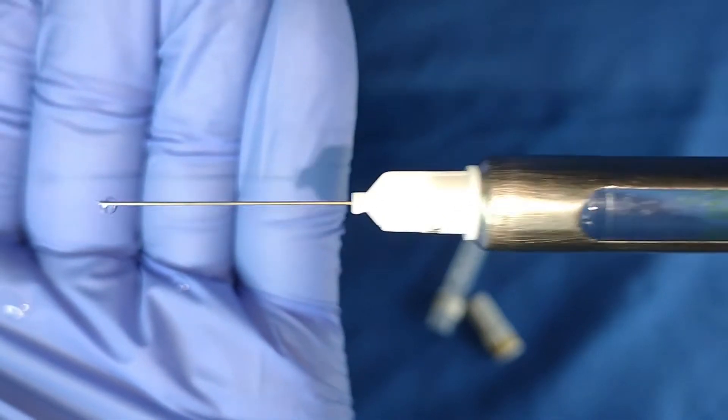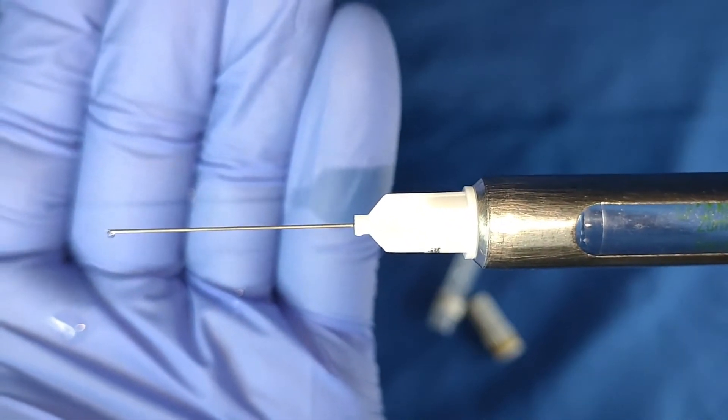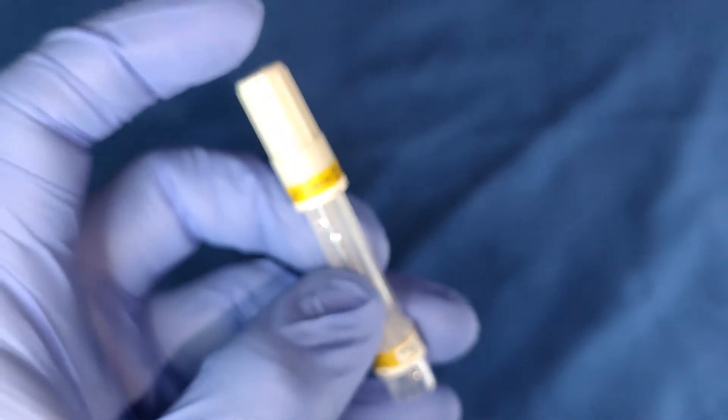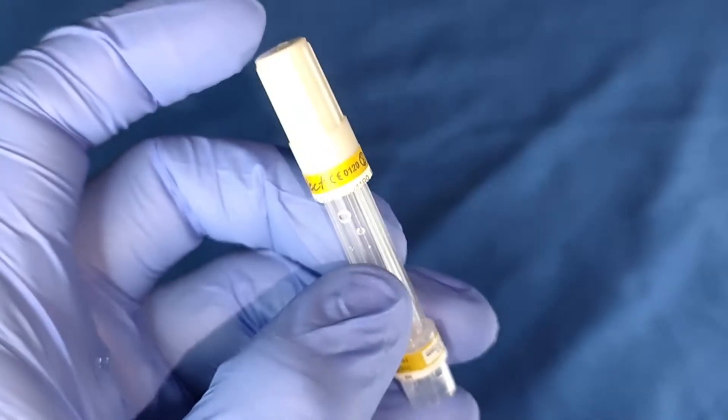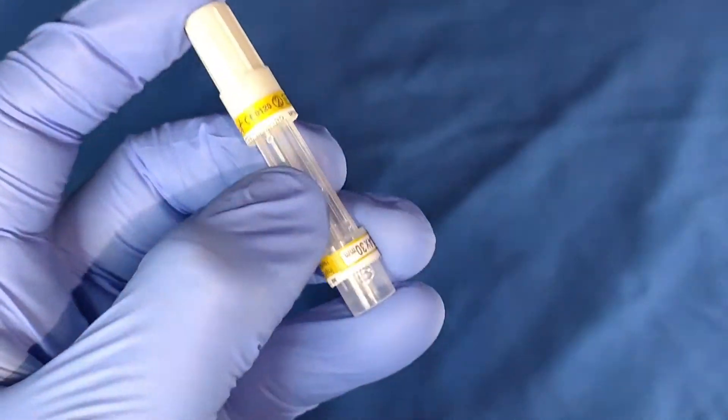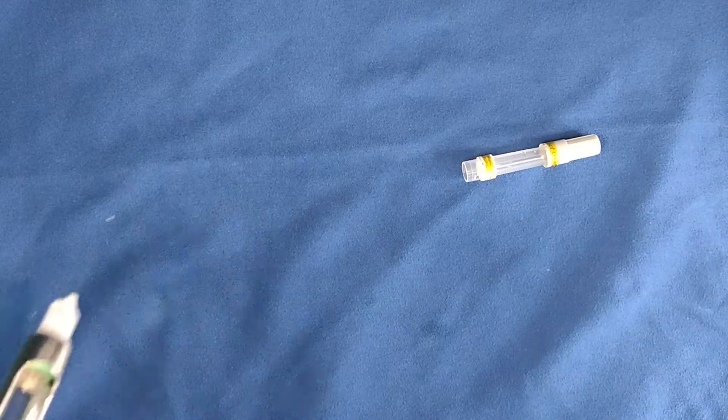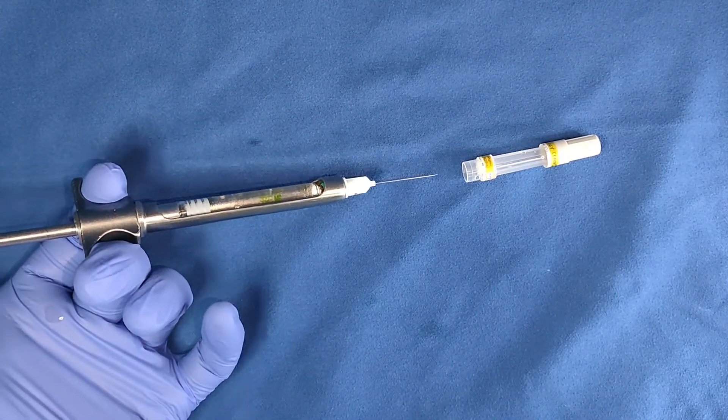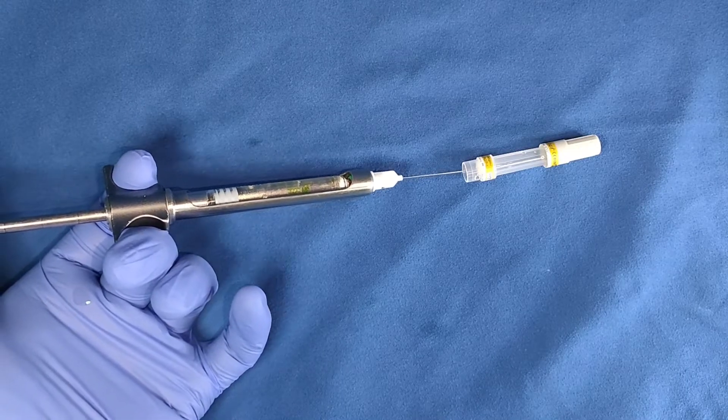You're now ready to administer local anesthetic. This small cap, make sure to not throw it away. Place it here at the end of the bigger cap. I'll show you how to close it. Use the one-hand scoop method.